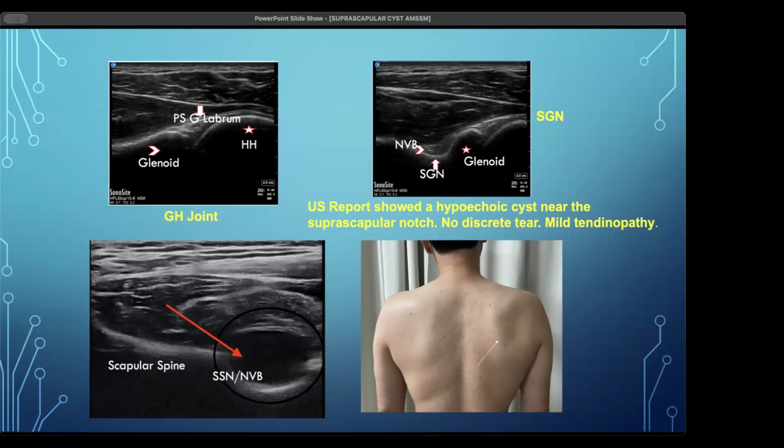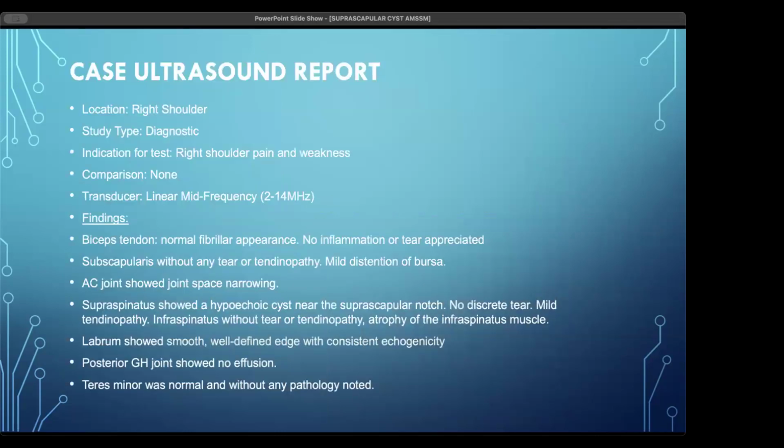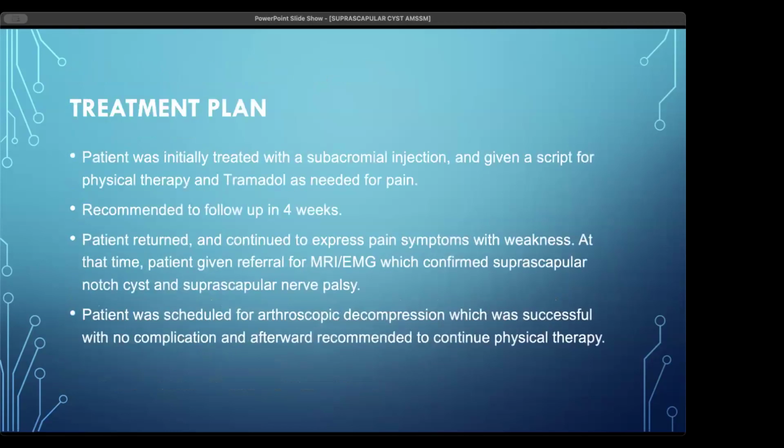I was just realizing that in that image, typically it's going to be a short axis rather than a long axis view of the nerve diving through. The only other things I was going to bring up for pathology: you had mentioned cysts are very uncommon in this region, but this is where ultrasound can be really helpful to evaluate. You can always get MRI for further confirmation. The other typical pathology you'll see this with, as you mentioned, is the AC joint, if there are a lot of degenerative changes in that area.